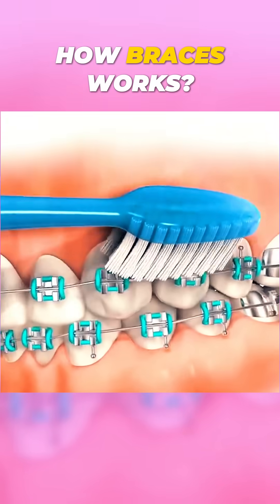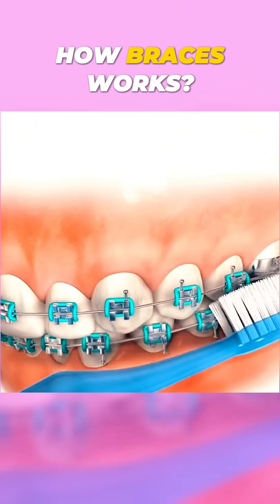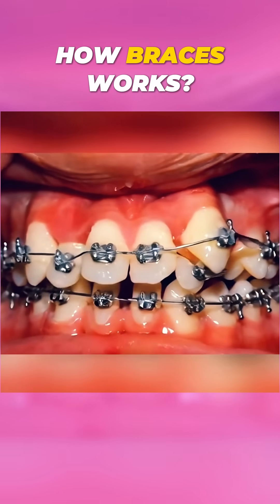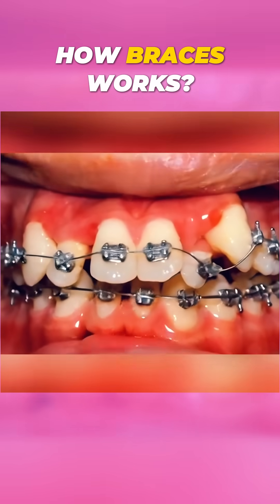Did you know over 4 million people in the U.S. wear braces and millions more worldwide? You're not alone in the journey to a better smile. Follow for more dental tips.